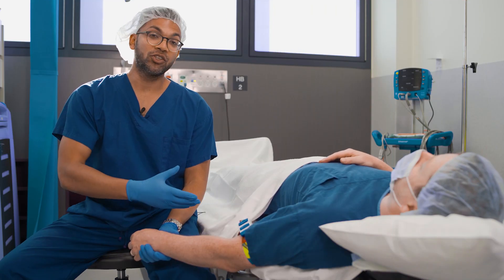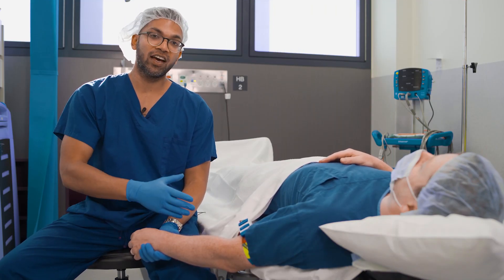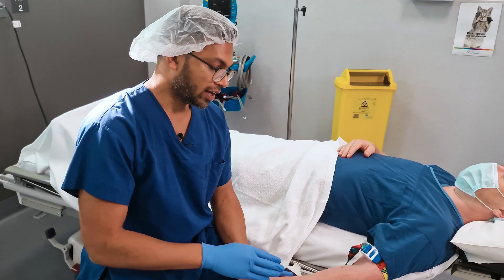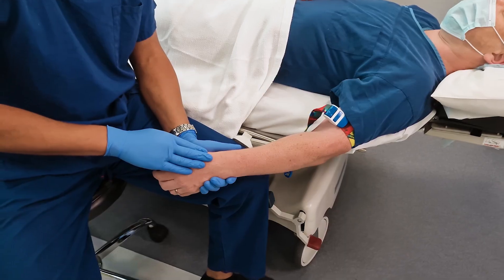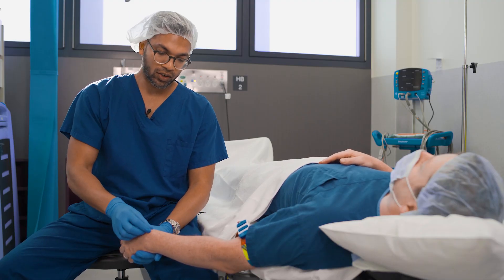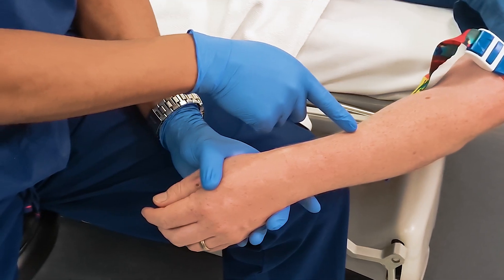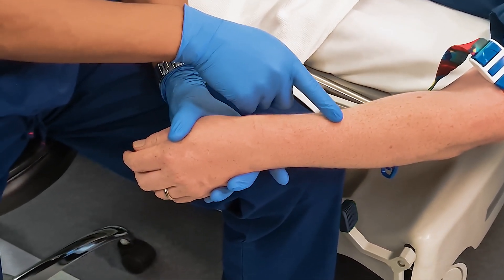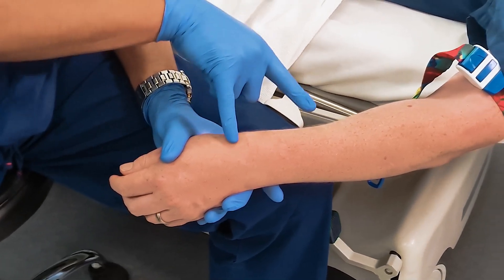As a general rule you can choose any vein you want — it's just that some veins have certain advantages and other veins have certain challenges. I would always go to the most distal site that still satisfies the purpose. For example, I've got this really long cephalic vein over here. Now if I was to attempt cannulation here but I messed up, you'd get a hematoma and potentially a clot inside the vein.